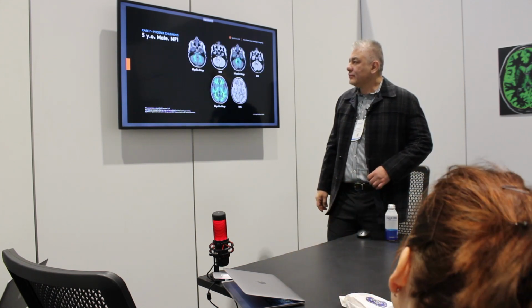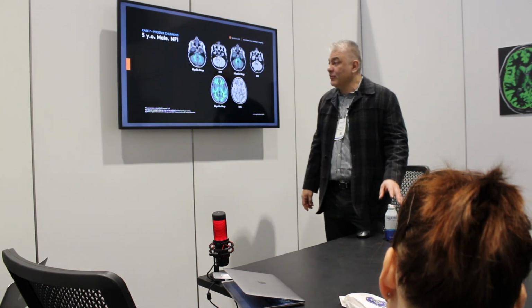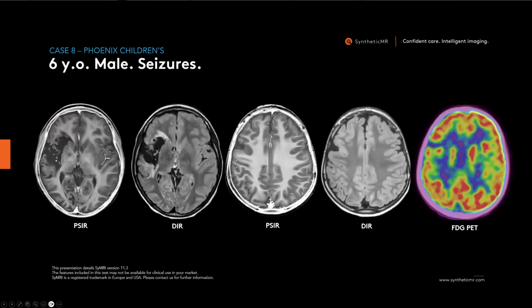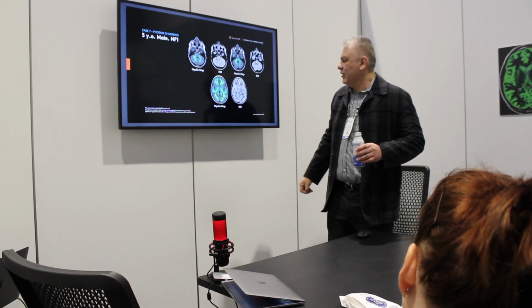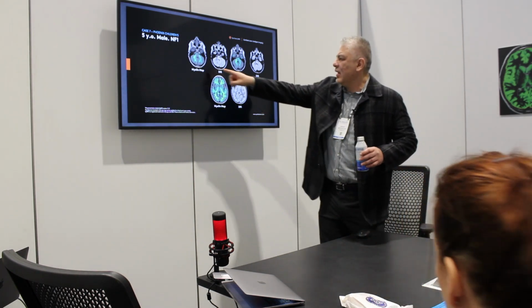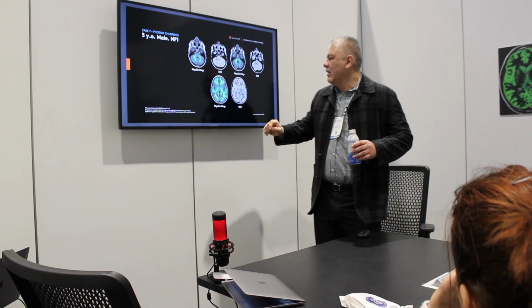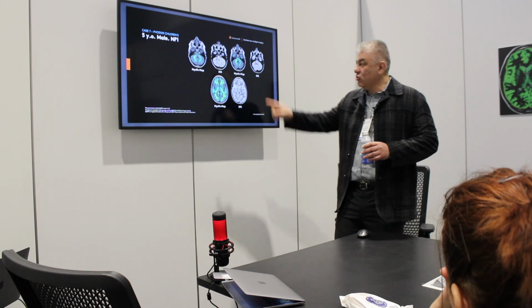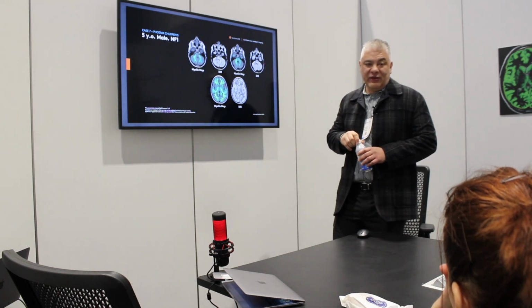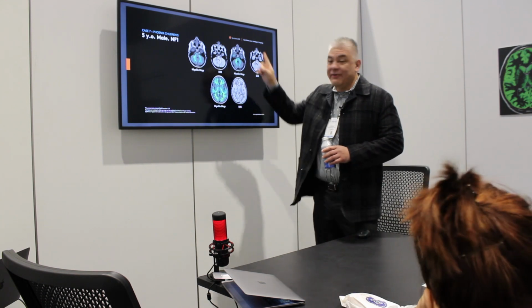Next. So, different case, neurofibromatosis type 1. Again, you have all these foci of myelin vacuolization. So you would obviously expect to have less myelin on those foci, like this, for example, right around the posterior limb of the internal capsule. On the myelin map, you see, yeah, obviously that's a lesion. You can also see another lesion here in the right white matter and right cerebellar hemisphere, and you can see the decrease of myelin there. But you also see a significant decrease in global myelin in this patient with neurofibromatosis, not just on the foci of myelin vacuolization, but everywhere else.